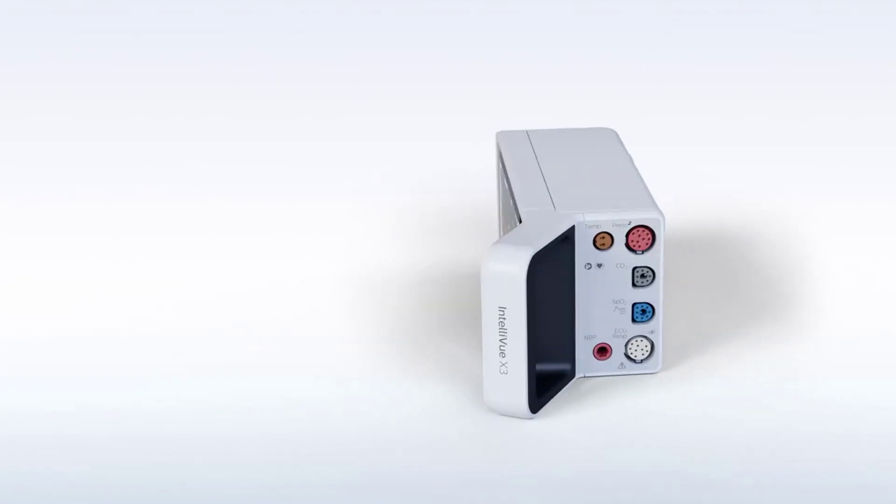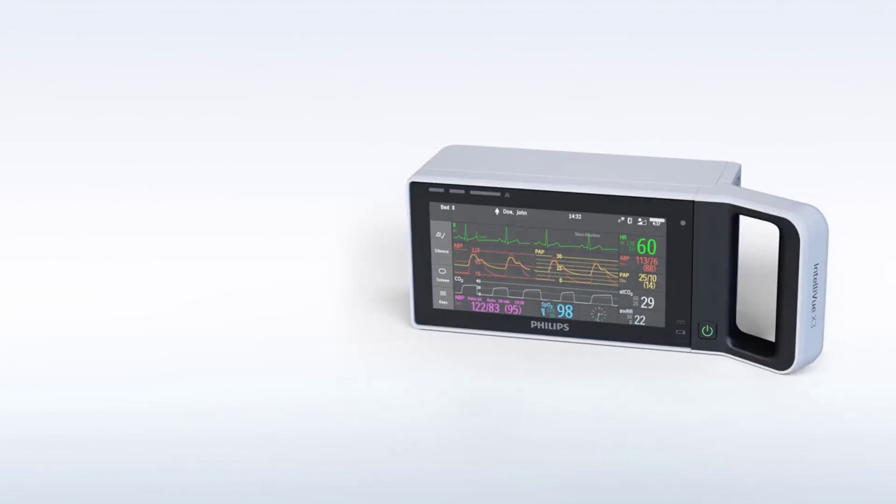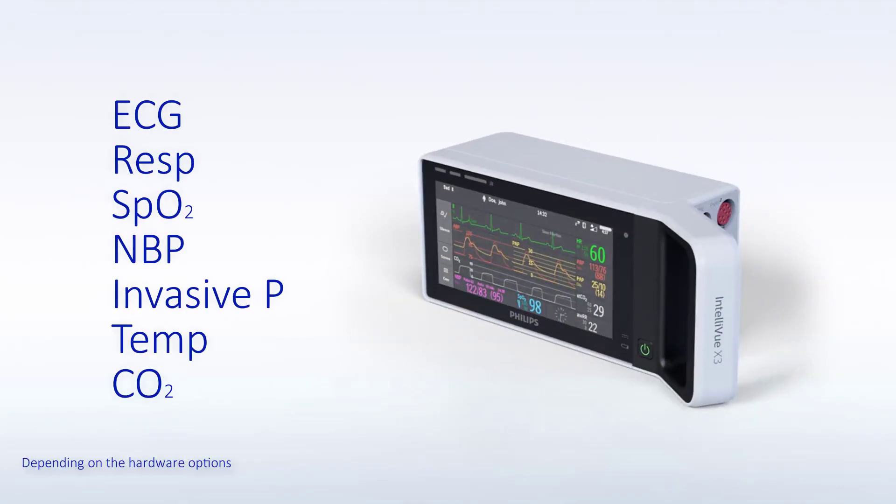The Intelliview X3 is a versatile patient monitoring device. It can simultaneously monitor ECG, respiration, SpO2, NBP, two invasive pressures, temperature, and CO2.